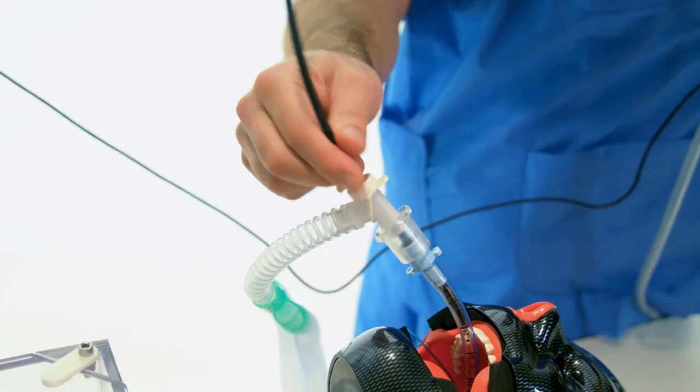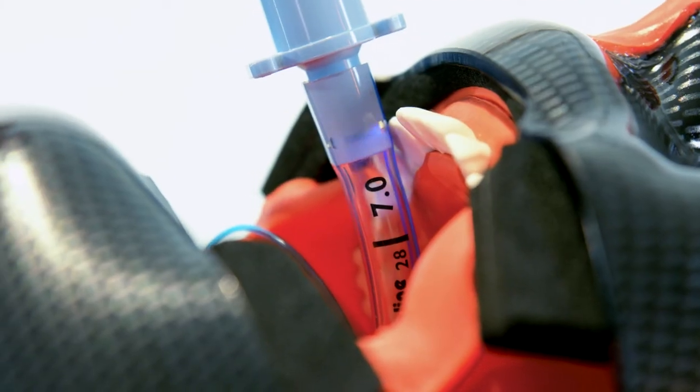If necessary, lubricant solution can be applied to facilitate the insertion.